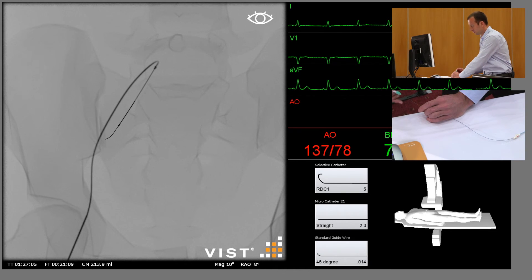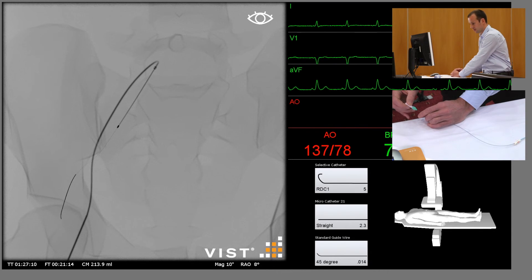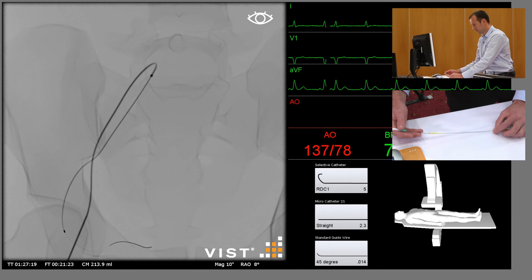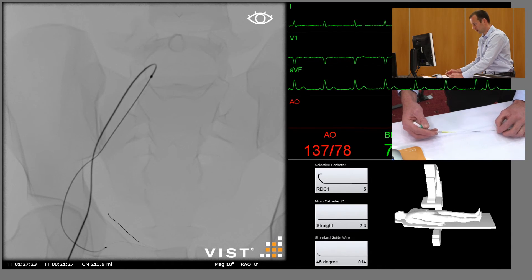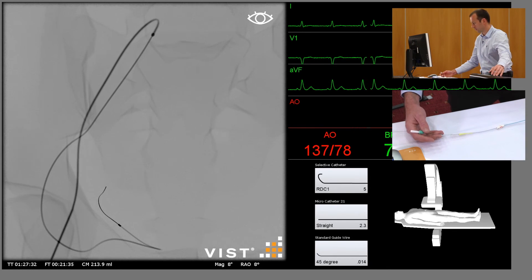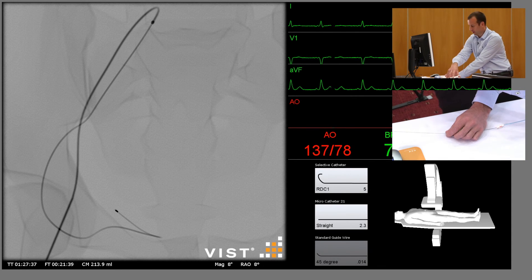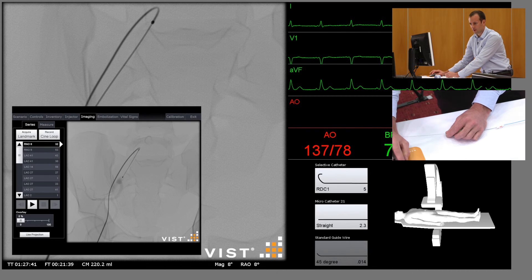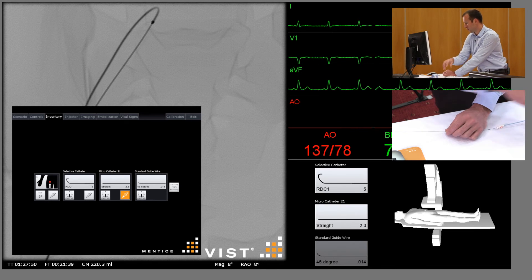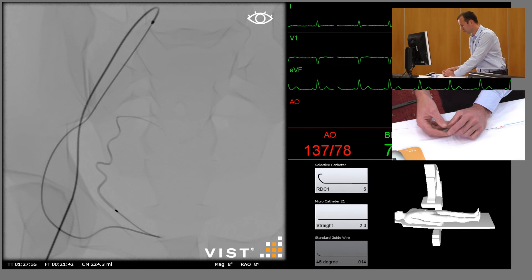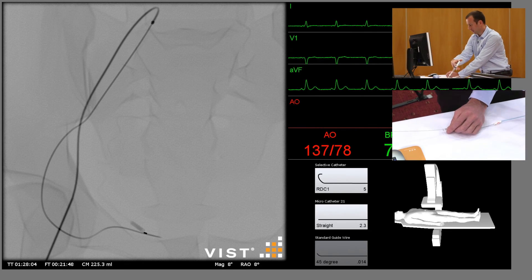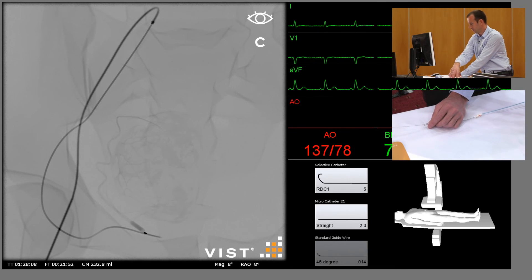Reinsert the 014 wire and follow with the micro catheter as we advance it down the uterine artery. The aim is to get relatively distal. I think we'll magnify the image and centre a little south. Remove the guide wire, inject some contrast — we're probably a little too distal there, so we'll just come back — and then do an angiogram. And you can see the fibroid opacifying nicely.